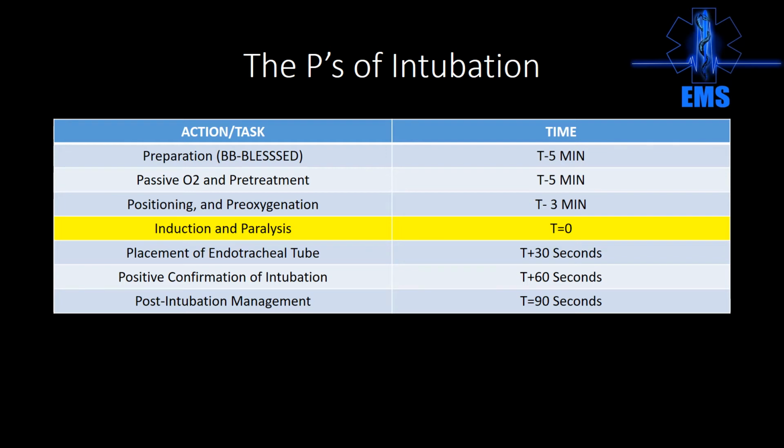The intubator, the person who's actually going to be placing the tube, should do their own checklist. They should assemble their own gear. Everybody wants to be a friend and help out, but if I'm doing the procedure, I need to have positive control over the stuff that I'm going to use because I need to know A, where it is, and B, that it's there.